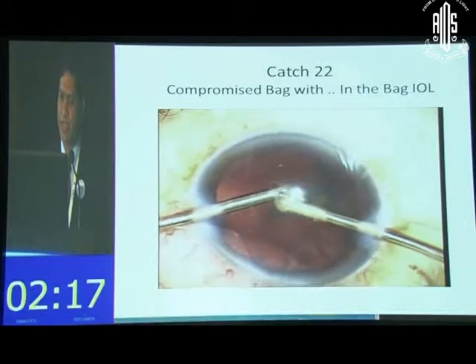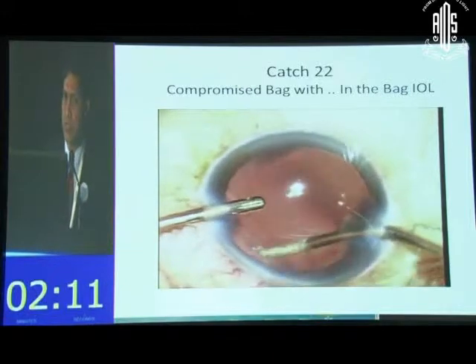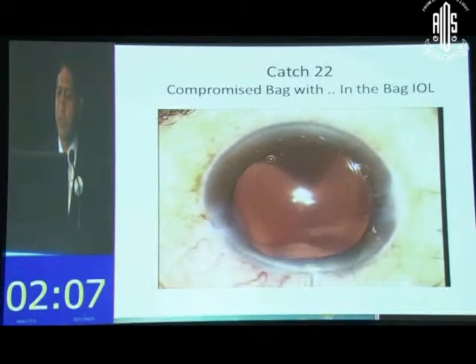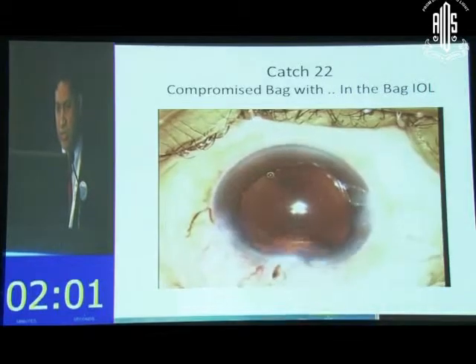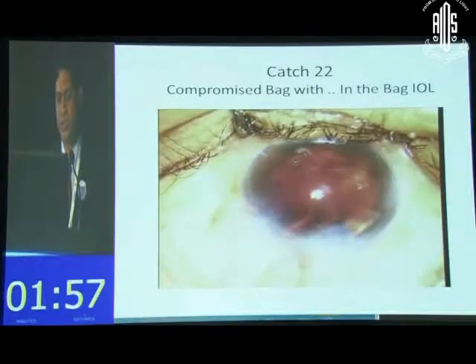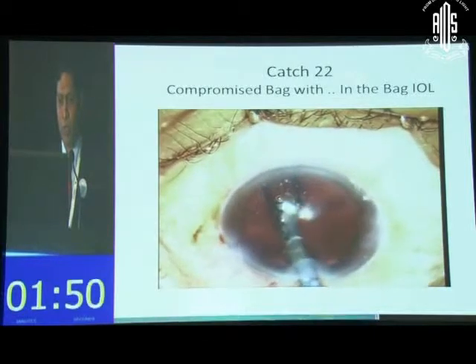That looks nice. I'm showing you all this to show that nothing really went wrong throughout the surgery. And you see how I literally messed up a very clean situation. A Technis 1 IOL, I've been using it for as long as the Technis 1 IOL has been in this country, probably one of the first users of the Technis 1 lens. Just see what I'm doing as I inject the lens. Now that was fine.